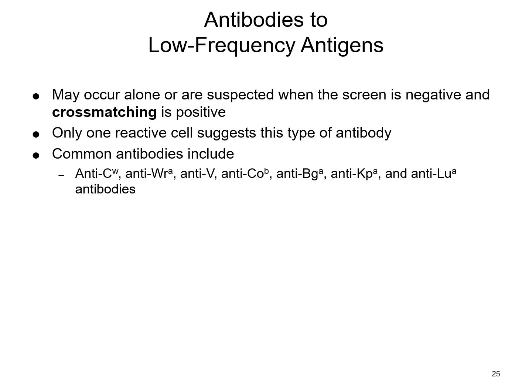Anytime that cross match reacts, something's going on, so you need to stop and take a pause, because if it reacts in the tube, what do you think is going to happen in that patient's body? When you take that pause and start investigating, you may be inclined to do an antibody panel, and when you do that panel, you'll have that one cell that reacts with something like a Cw or a Lutheran A or something like that. That's your indicator: you look negative, but then you do your cross match and you have a positive reaction.